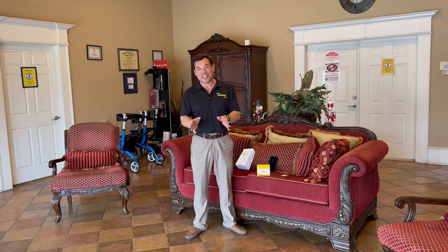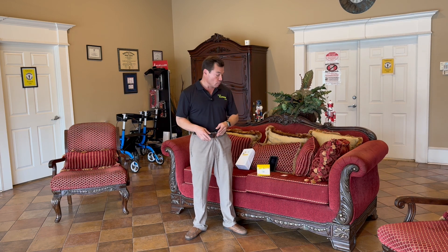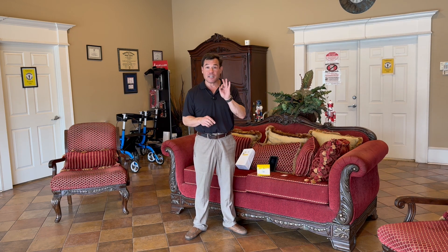Hello and welcome again to Habibi's Home and Habibi's Durable Medical. Today, as we promised a long time ago, we are going to get to continuous glucose meters. The particular continuous glucose meter that we offer is the Freestyle Libre — we offer both the 2 and the 3.